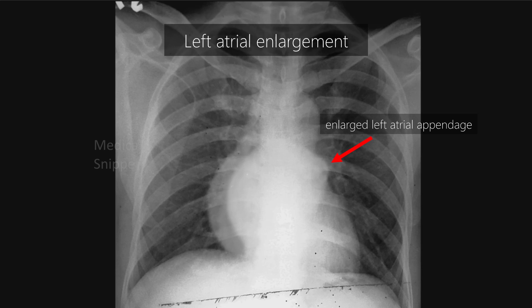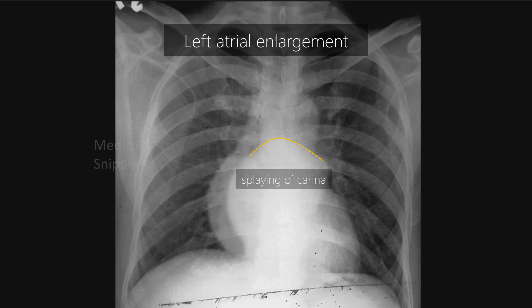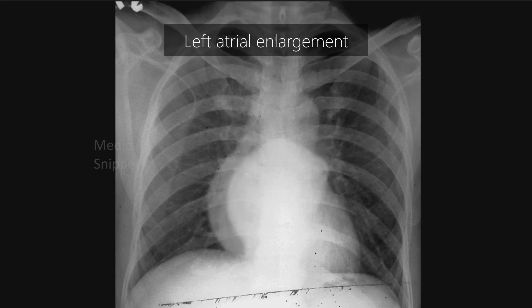The enlarged left atrium pushes the left main bronchus upwards, resulting in splaying of the carina. One more method to measure left atrial enlargement is the distance from the midpoint of the left main bronchus to the right border of the left atrium, and this distance should be more than 7 cm.